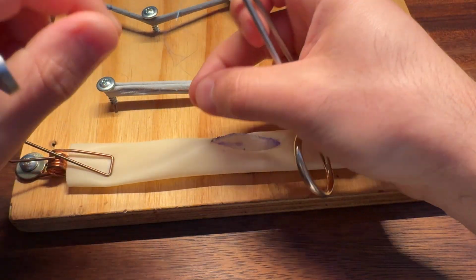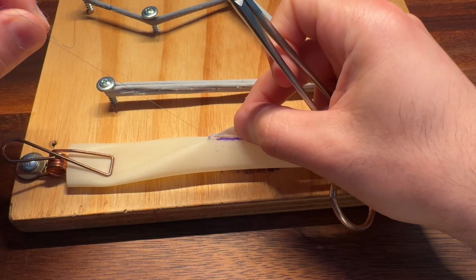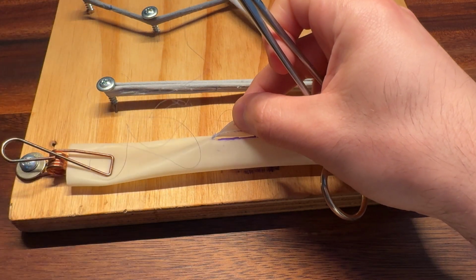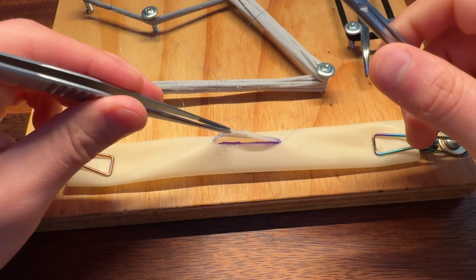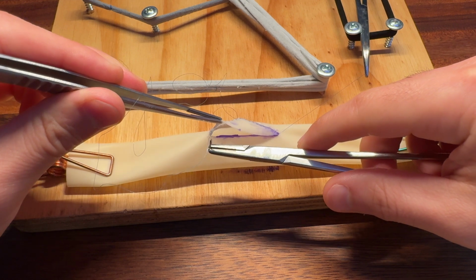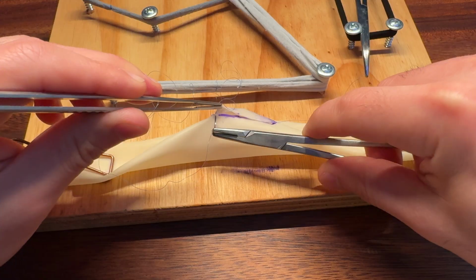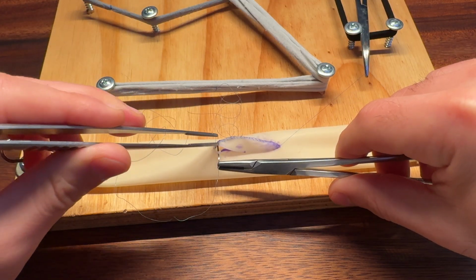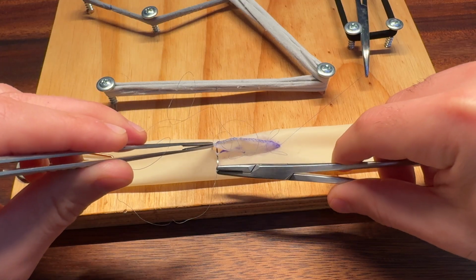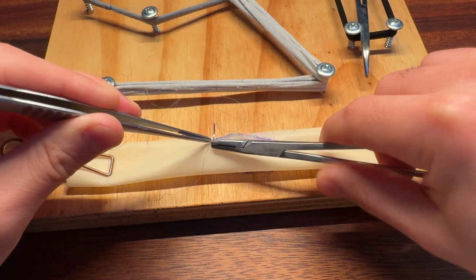So the technique I like here, maybe some traction is going to help. It is kind of tricky. Another thing that I've seen surgeons do is using some sort of traction, something like that. I can take this in one bite. Nope. It might be easier to take in one bite.